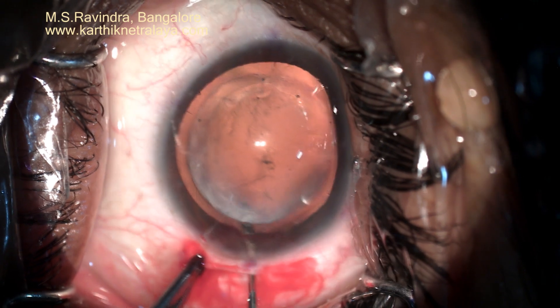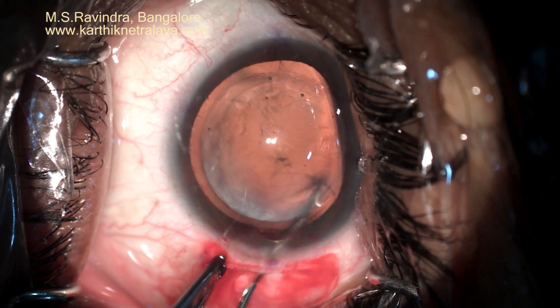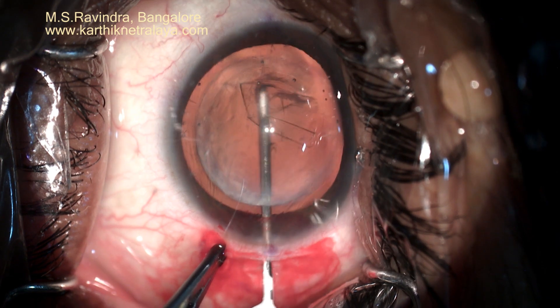As the chamber is well formed throughout, and there are no wrinkles in the cornea that are often seen when you go to the extremes of the tunnel width, a comfortable capsulorhexis could be created.